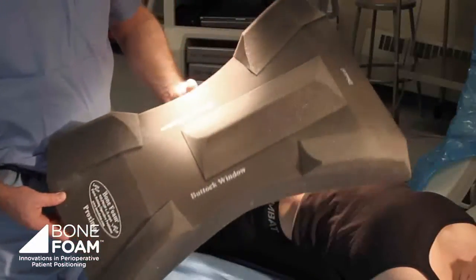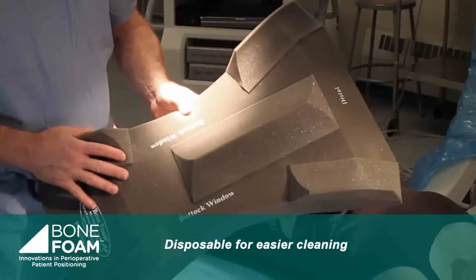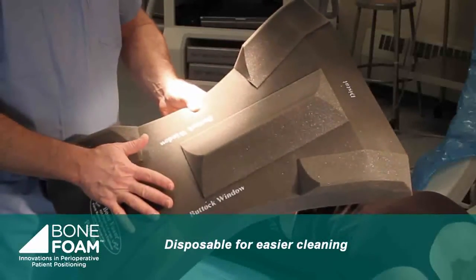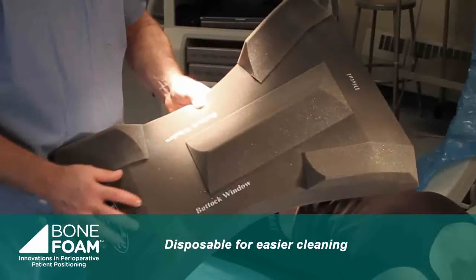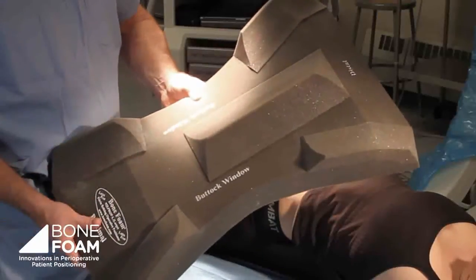But the other thing that's different here is that this is a disposable. So this is the open cell foam, non-coated, and it provides the same buoyancy, the same support. We have found that some surgeons prefer the disposable because they can get bloody and soiled, and these work well for that reason.